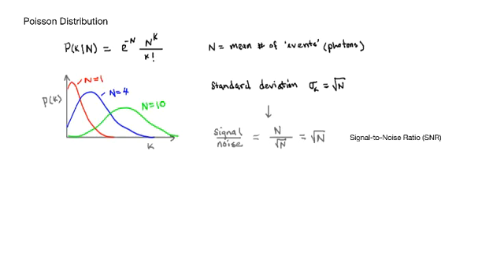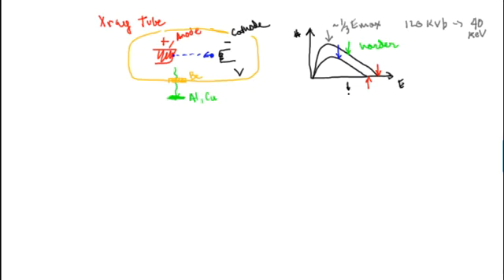So how do you get more photons onto a detector? Let's look at that. One way to get more X-rays at the detector is to get more X-rays out of the tube. We studied X-ray tubes in video 8.1; you can go back and look at that. You'll recall that you can get more photons out by just increasing the current in the tube, the number of electrons per unit time, the mA. That shifts the whole spectrum up and down. So exposure is going to scale linearly with mA, with the current in the tube.